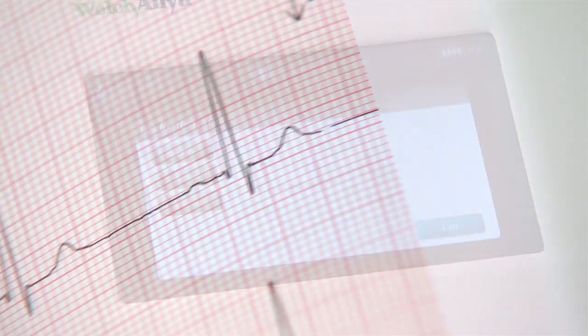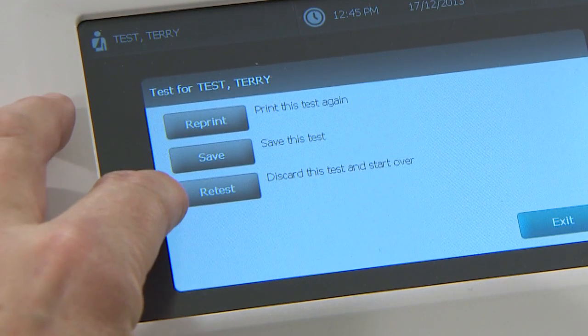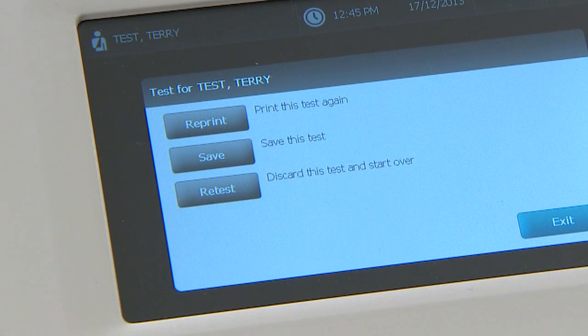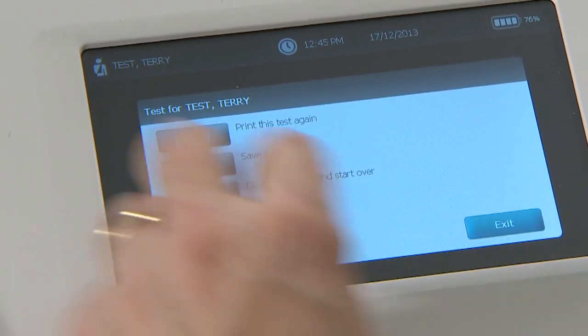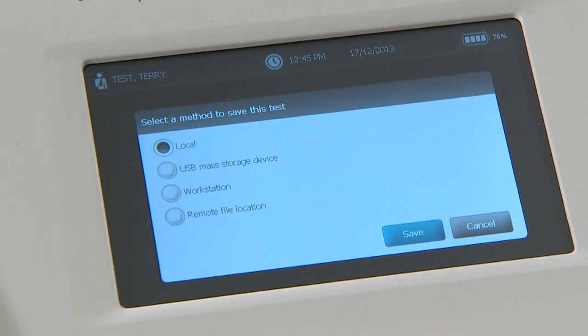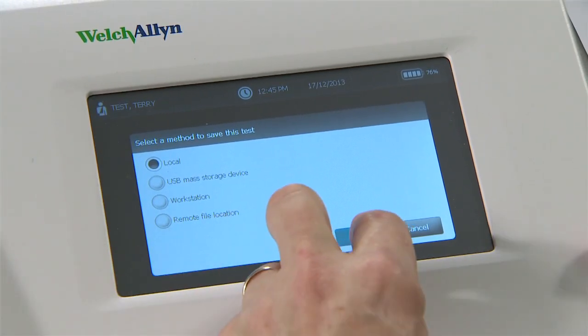At the end of the ECG you'll be given the option to reprint the test, save it, or do the test again. If you choose to save the test to the ECG memory, touch the save button and then choose the local option followed by save.